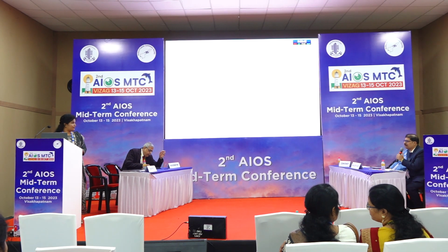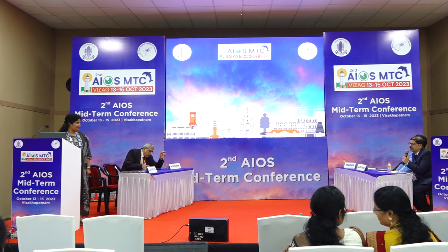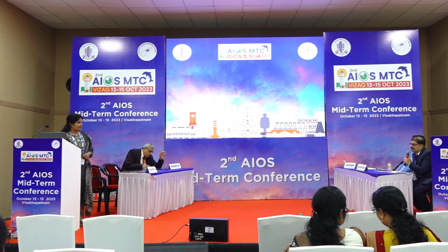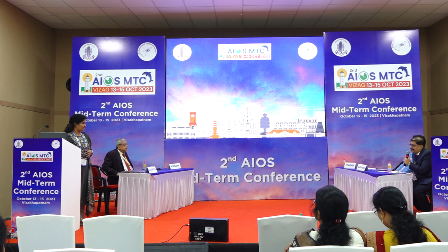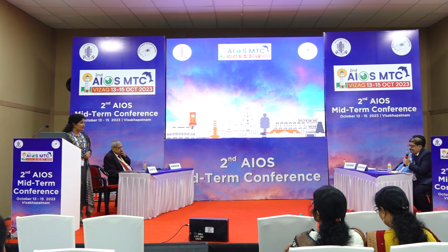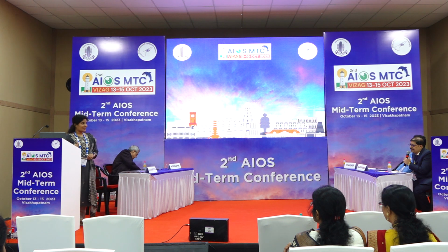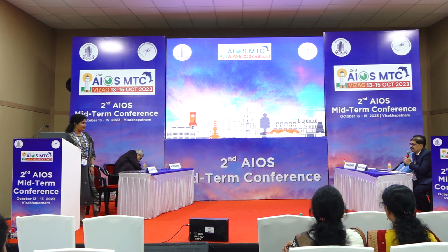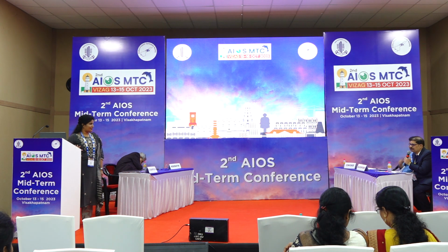So, what is one common thing between Barrett 2 and SRKT? In SRKT, we use theoretical and regression approaches. Both are calculated in this; we do not do it manually. It is done only in a biometer, or we will have a calculator. So the machine uses regression formulas and arrives at a particular value. Yes, in both.